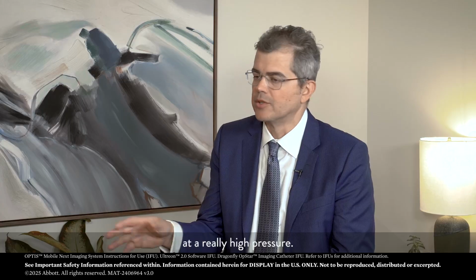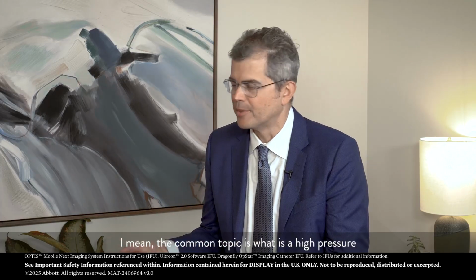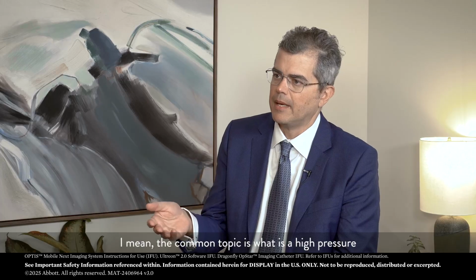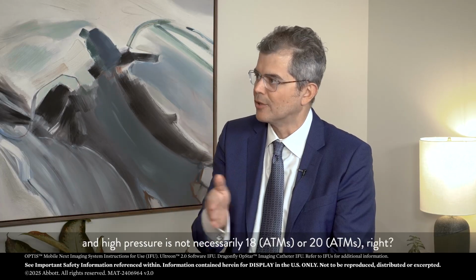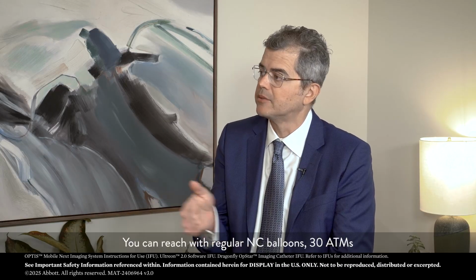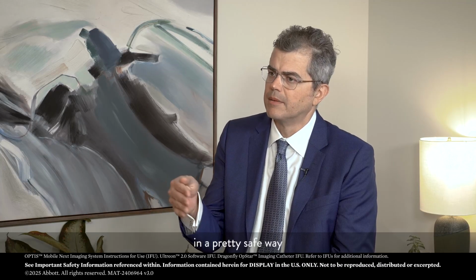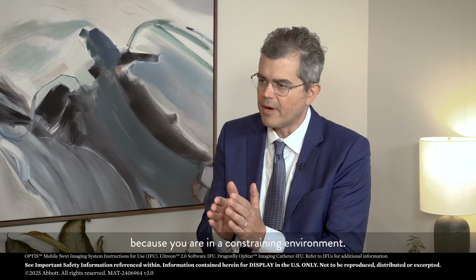at really high pressure. I mean, a common topic is what is a high pressure, and high pressure is not necessarily 18 or 20, right? You can reach with regular NC balloons 30 ATMs in a pretty safe way because you are in a constrained environment.